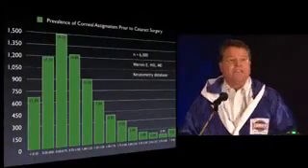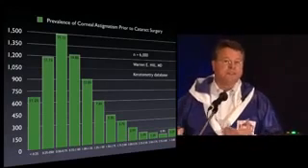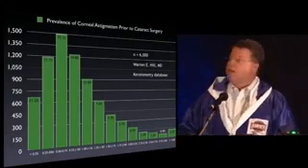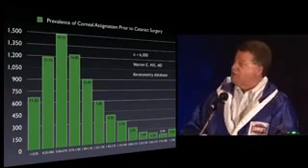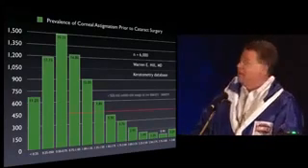Okay, well, let's talk about Ks. You know, what is it that makes this instrument so much better for keratometry? Well, you know, why did Willie Sutton rob banks? Because that's where the money is. Well, look where most of your Ks are. They're way down at the lower level.